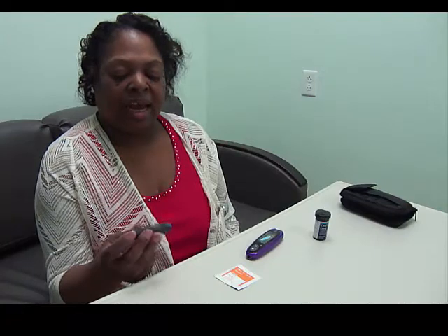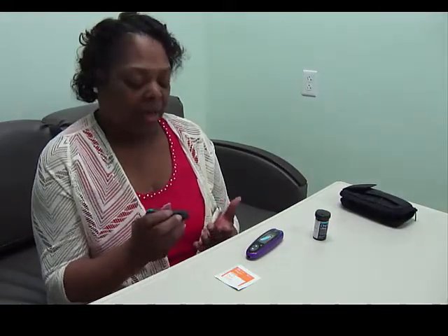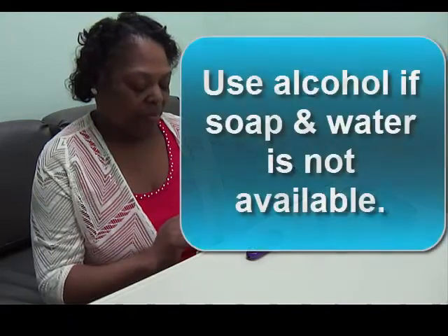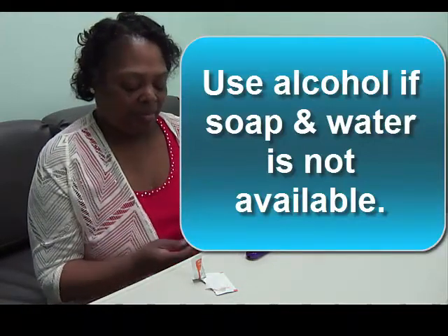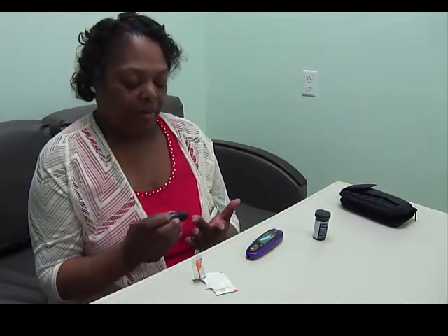So I start off with this, my little trigger for my lancets. I keep mine on 4. That's a comfort level for me. It's good to know which number to put it on, so you're not too afraid to stick your finger. And I always stick on either side versus in the middle, so that I know it's not going to hurt, and plus I get a true reading by doing it on the side. Before I stick, I use my alcohol and do my finger and let it dry. I had already put my little lancet in here. All right. And that didn't hurt at all.